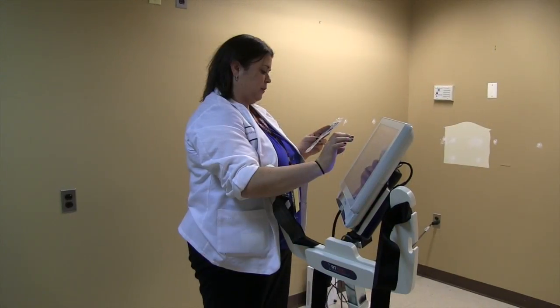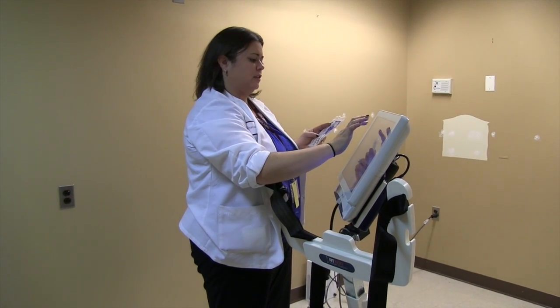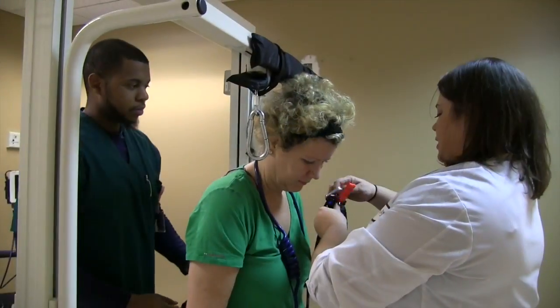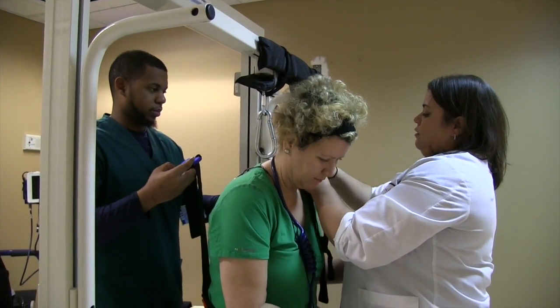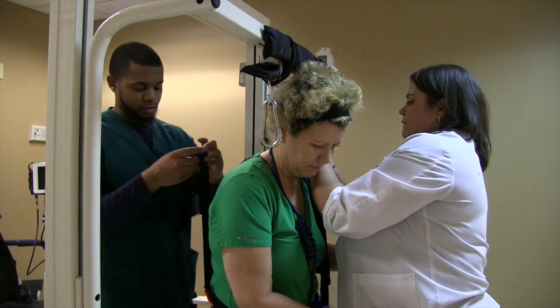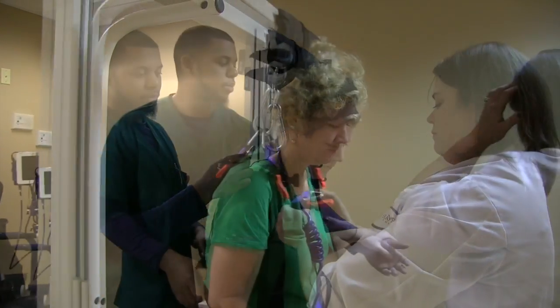We're going to connect Britta's personal ID number into the system — 127D — so it has all her settings downloaded and saved. We're going to connect the harness to the hoist. Ready to fly?